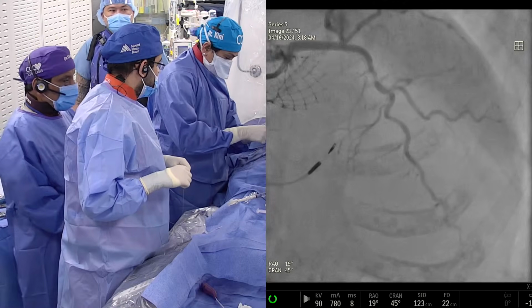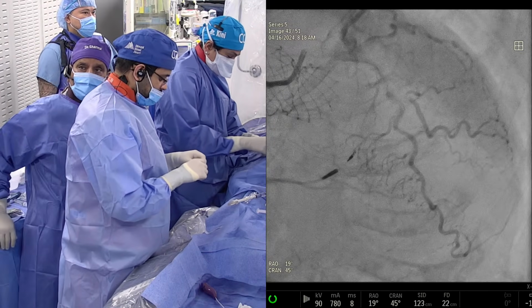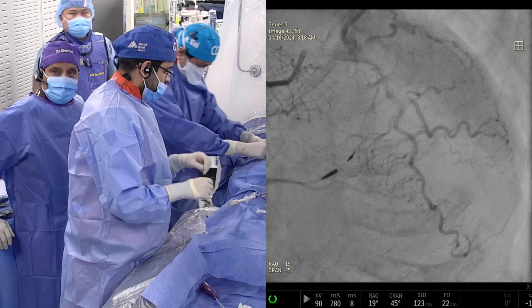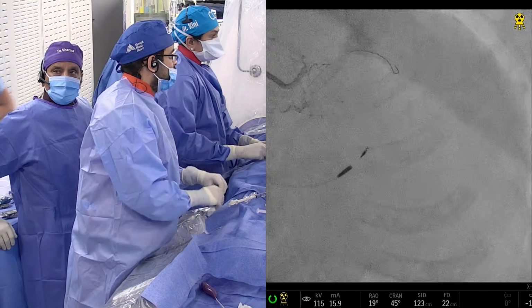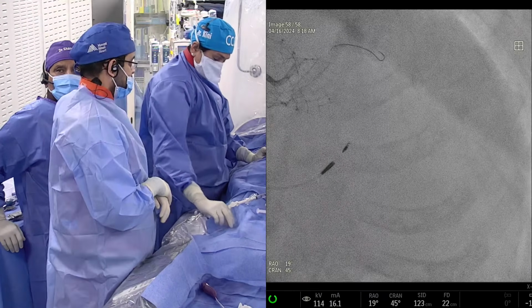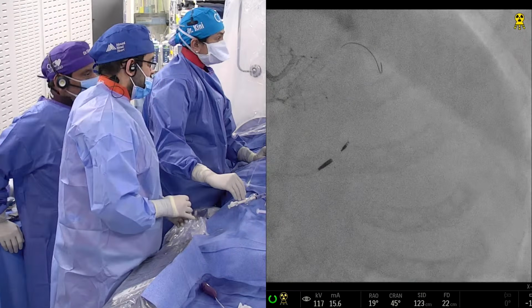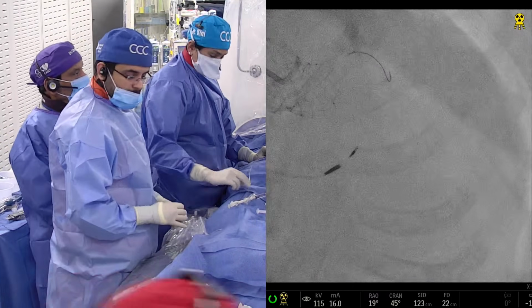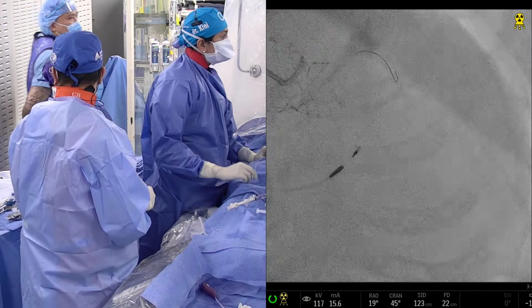And we are using a 6 French guide, and people do ask, can we use a guide liner? Yes, you can use a guide liner to put your rota bar, but it requires 7 French. In some cases orbital may go through the 6 French guide or guide liner, but otherwise you require the bigger guide catheter if you need to use these atherectomy catheters, particularly the rotablation; even 1.25, 1.5 can go through the 7 French.